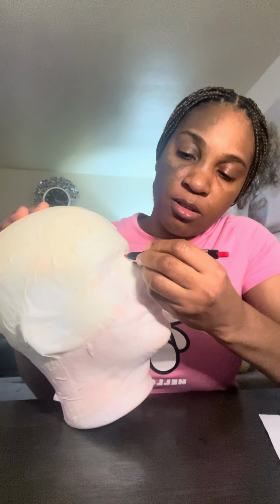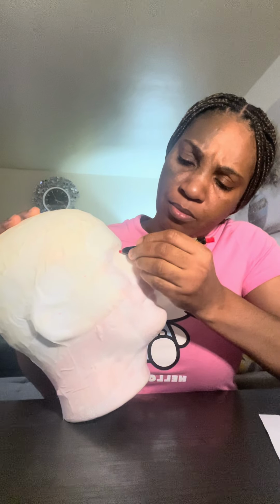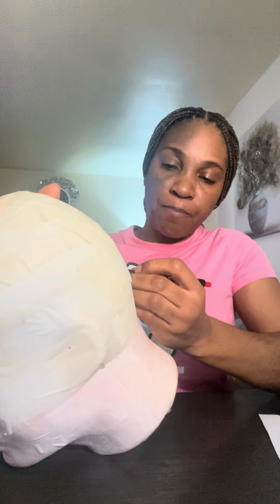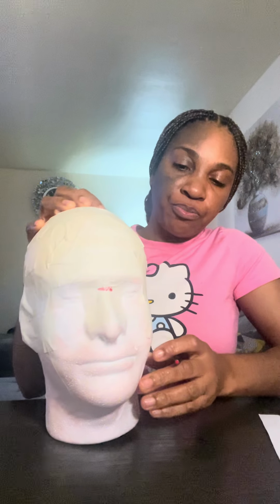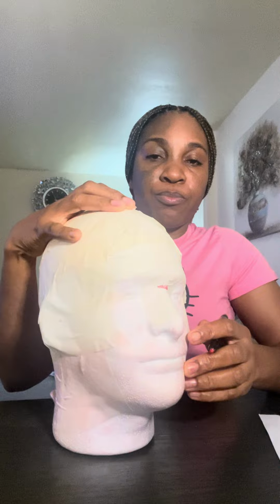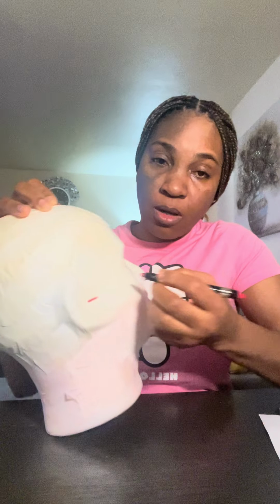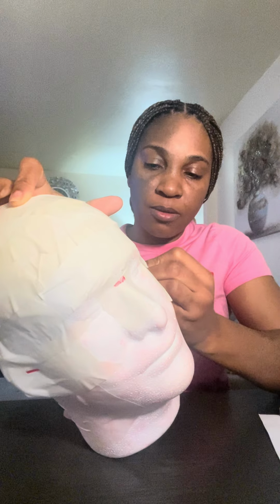First of my measurement, I'm going to take the landmarks, which are Nasion, Inion, preauricular left, and preauricular right. Okay. These are my landmarks. Now I'm going to start with the measurement.